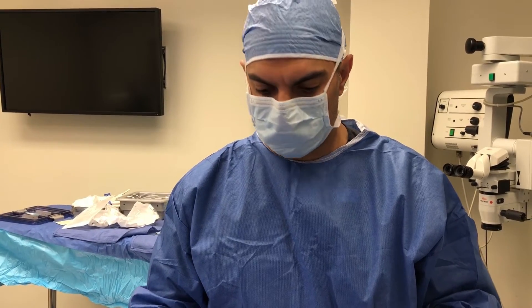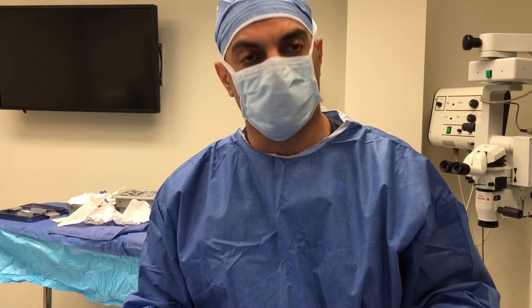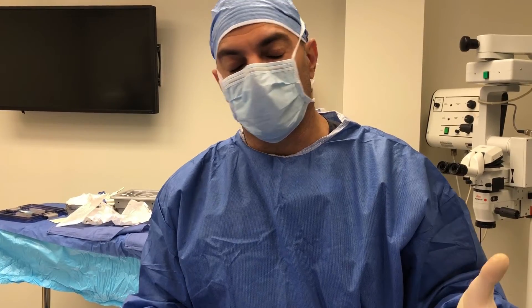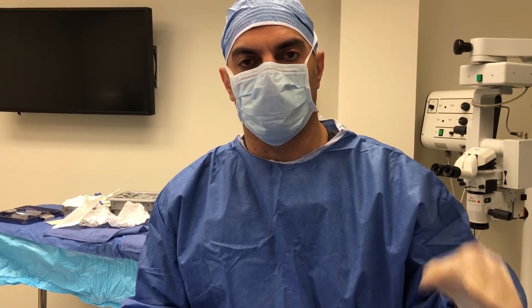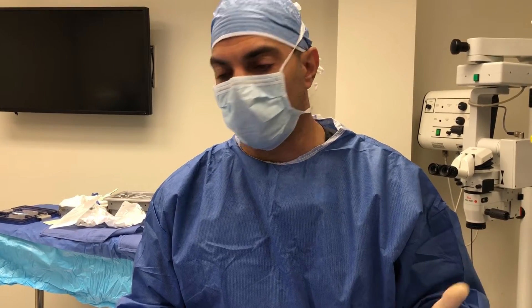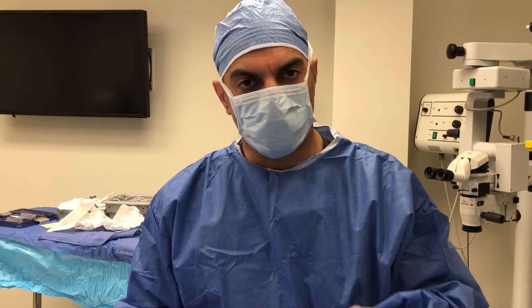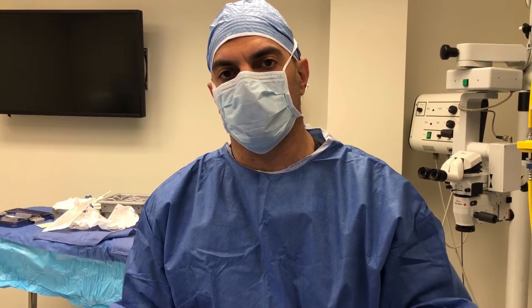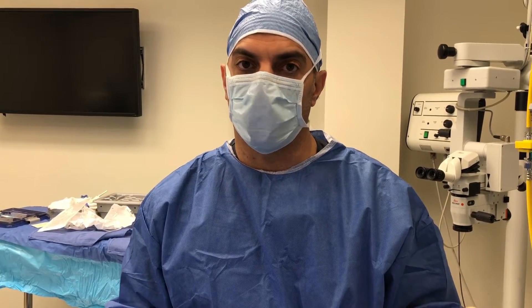We're doing a round of dermabrasion on this patient. She has something called neurofibromatosis. It can be done on any patient with a texture problem or irregularity of the skin. It's commonly done on the face. In neurofibromatosis there are a lot of textural problems around the mouth, forehead area, and it's a very common problem.